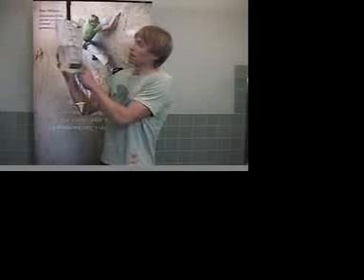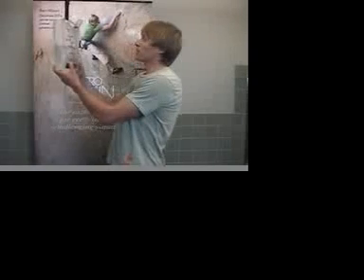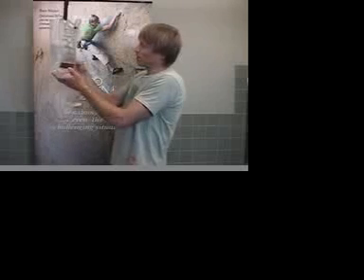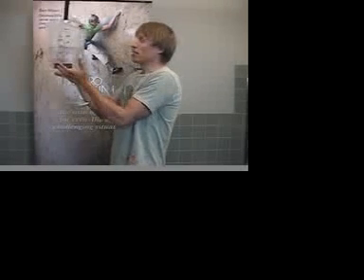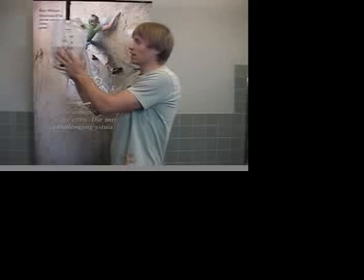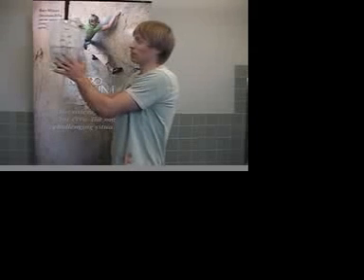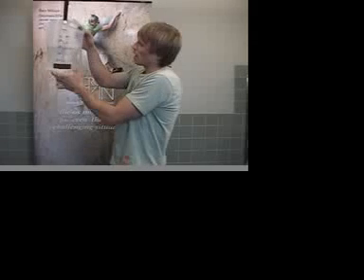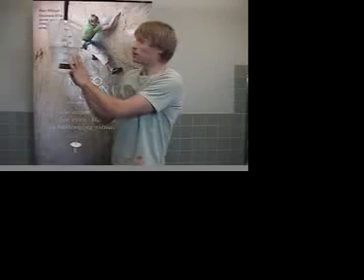Basically, this is just an irrigation system, this one's made by Coloplast. There's several on the market. I fill it up with approximately 1.5 liters of body temperature water. You can use trial and error. I just found that temperature, not too hot, not cool, worked the best for my system. I've read a lot about other people finding other things that work better for them, so you have to play with it to find what works best for you. And I found this amount of water works best for me as well.